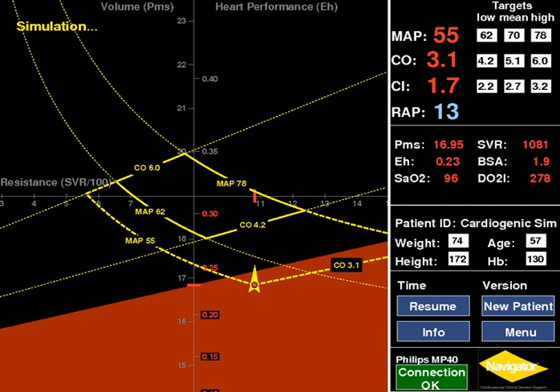Likewise, the right scale is the heart performance EH scale and measures the capacity of the heart to pump. It moves vertically in response to changes in cardiac performance. The X axis is a resistance scale and measures the patient's resistive state or systemic vascular resistance, SVR. This scale moves horizontally to keep the target resistance in the target zone.